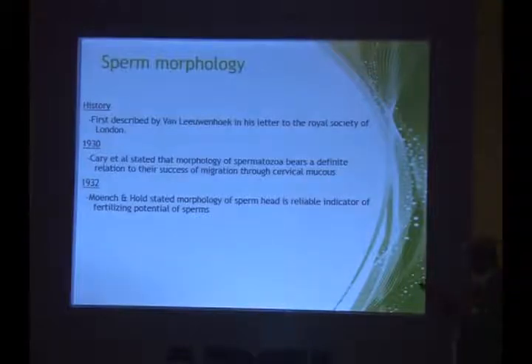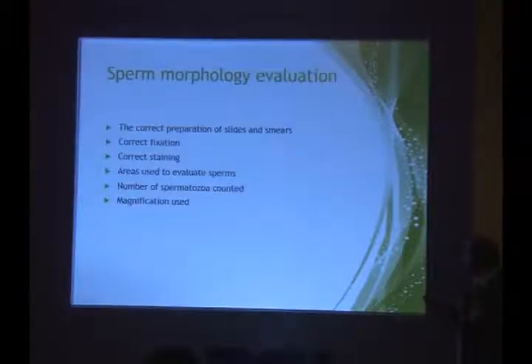Now we have already talked about sperm morphology, but for all of you to understand, one way was to look in the microscope. We had kept the microscope and show individual slides, but then I thought that will be too difficult for you. But if we have extra slides, we can give a couple of slides to them later, if time permits, or they can even take home, so they can observe at their own comfort in oil immersion, because each one of you will have to spend some time on the slide. So we will try to see that sperm morphology evaluation is done.